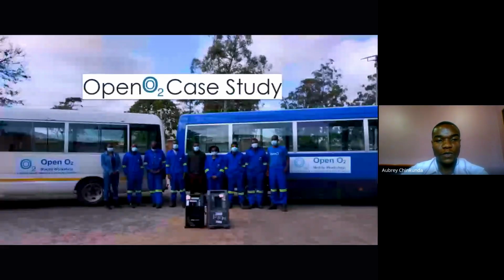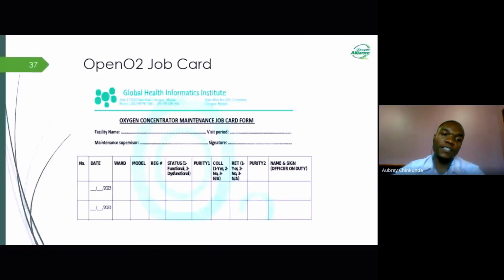Now that we have talked about the open source tools, let's focus on the OpenO2. We're going to share how we handle documentation here at the OpenO2 and how it's helped us so far. So this would be like an OpenO2 study on how we conduct our documentation. So firstly, that's an OpenO2 job card.